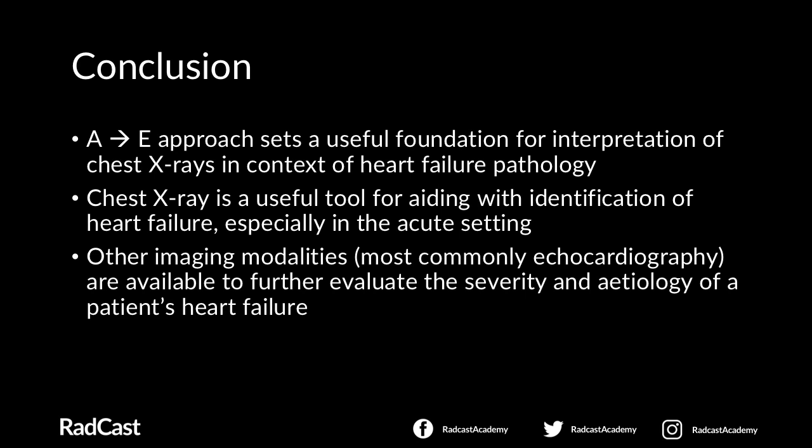Also, there are other powerful imaging modalities available, which are best suited for further evaluation of the structural and functional abnormalities which might contribute to a patient's heart failure. Further information such as severity and the etiology of a particular patient's heart failure can also be obtained. And I would say echocardiography is definitely the most common investigation utilised for this purpose.